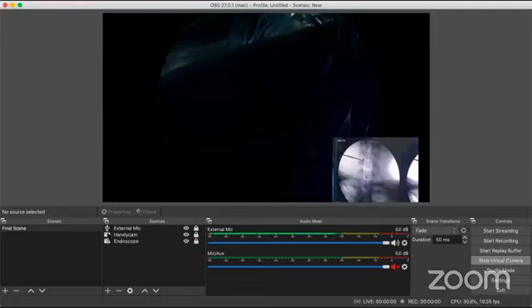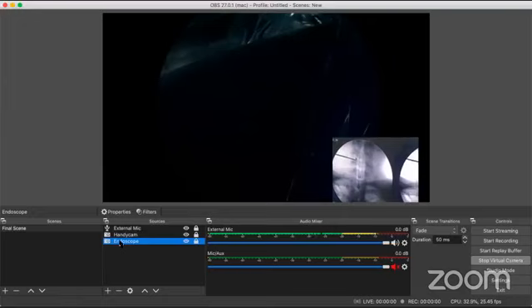But to reach this, I have to mark my entries. Now, how do I mark my entries? You always mark your entry to the spinolaminar junction. You never mark it to that point where you want to operate. You want to mark it to the spinolaminar junction because you want to establish your reach. So I'm marking my lower facetal entry point. It will cut the lower facet and go right till the spinolaminar junction.